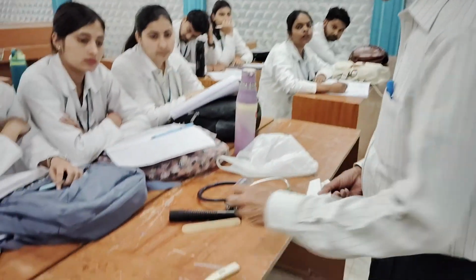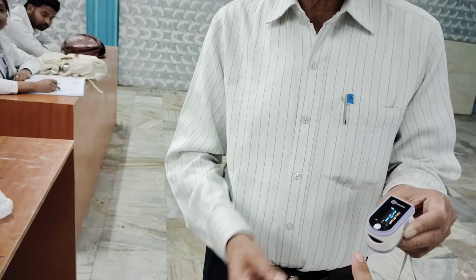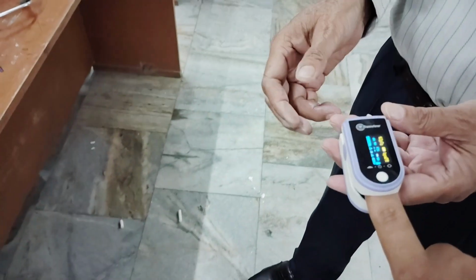So next is the very important pulse oximeter. This is the pulse oximeter. It will tell you about the oxygen saturation in the body. You have to press. Any volunteer can come. We will press it from here, make it on. You see, it has started working, and there is a red light in this, and we will place the finger under the red light, right? It will give the reading.